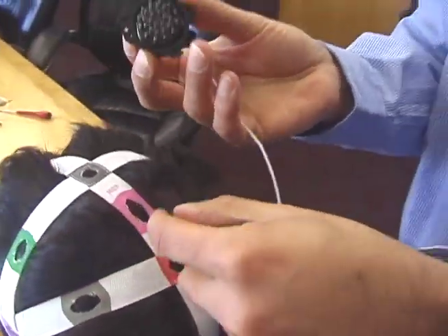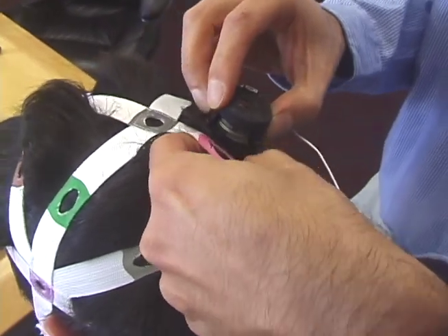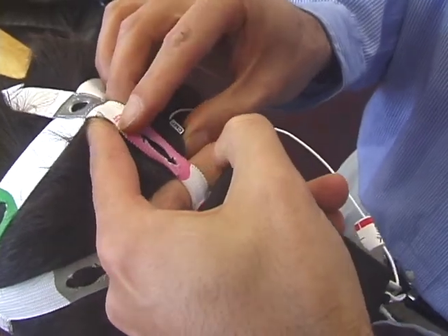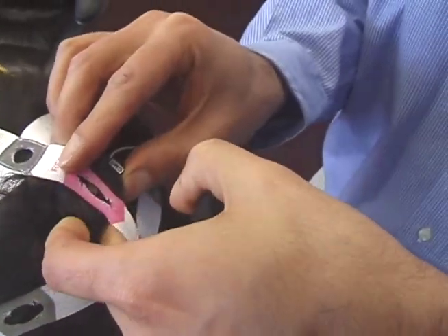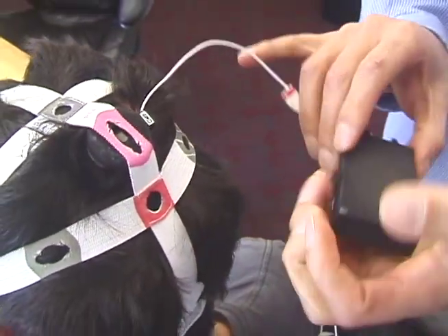Position the sensor pods under the brain net by lifting the net temporarily with one hand while sliding the sensor into position. Align the sensor hole with the hole in the brain net and release the net so that it attaches to the Velcro on the back of the sensor.